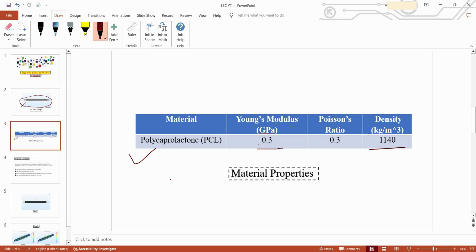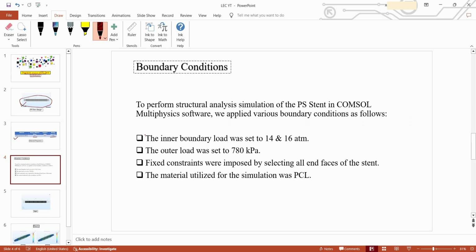As we know, if we want to perform any simulation or analysis of any particular design on software, we need boundary conditions. So in this case, what are the boundary conditions we are going to use? These are they. We are taking inner boundary load as 14 and 16 atm, and we are taking outer load as 780 kilopascal, which is actually caused by the plaque. And for fixed constraint we are just selecting all the end faces of the stent.